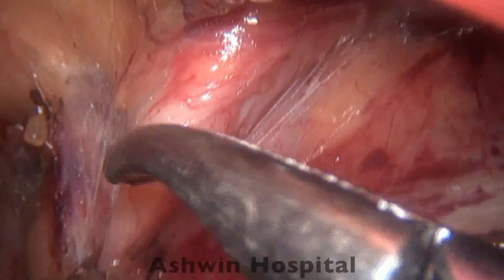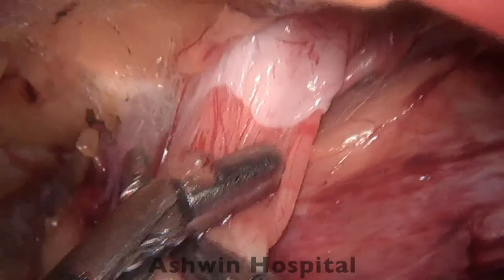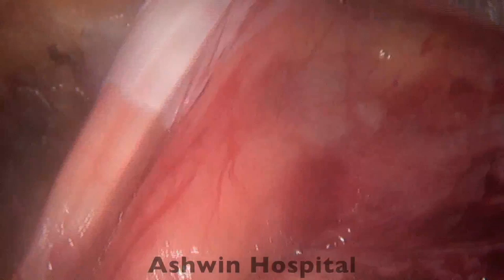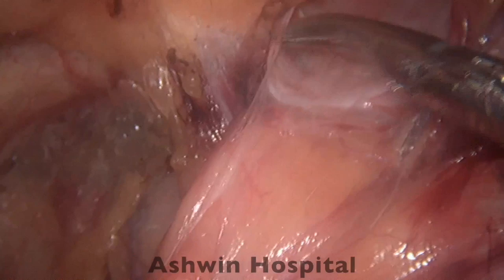So this is a large direct hernia where we are just reducing the pseudo sac without any energy, but we have to keep changing the traction closer to the area of the pseudo sac so that the traction would be very good and we can just tease the pseudo sac away. You can see when a slider is present, like the bladder being the content, then this is a very safe way of reducing the hernia rather than trying to use any form of energy. And you can see that is the end of the reduction of the direct hernia on this side.